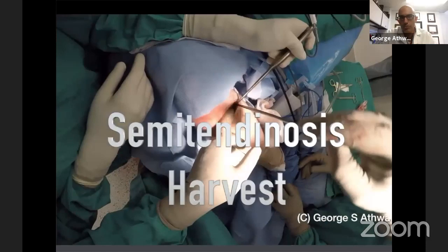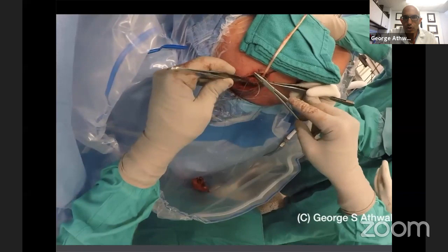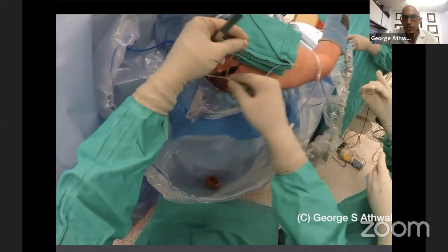We're going to harvest the semitendinosus, and here's our semitendinosus graft, which I'm now going to suture into the lower trapezius. I do multiple sutures. And there it is right there, give it a tug, nice and solid. And now I'm going to do a double loop reconstruction, very similar to an ACL.